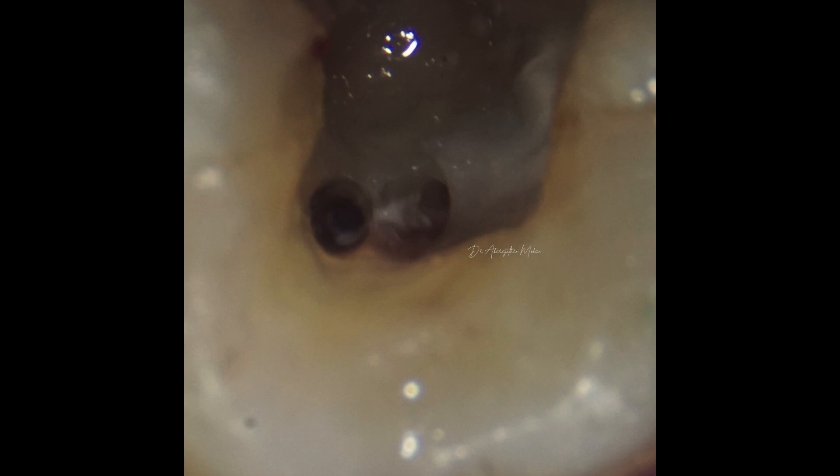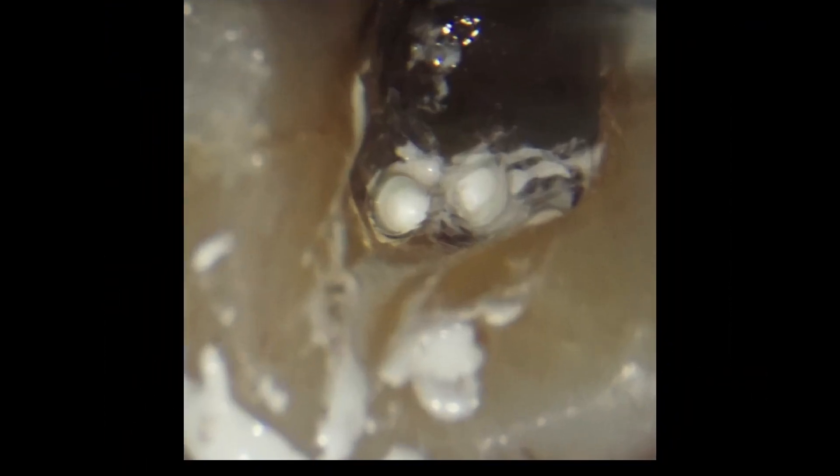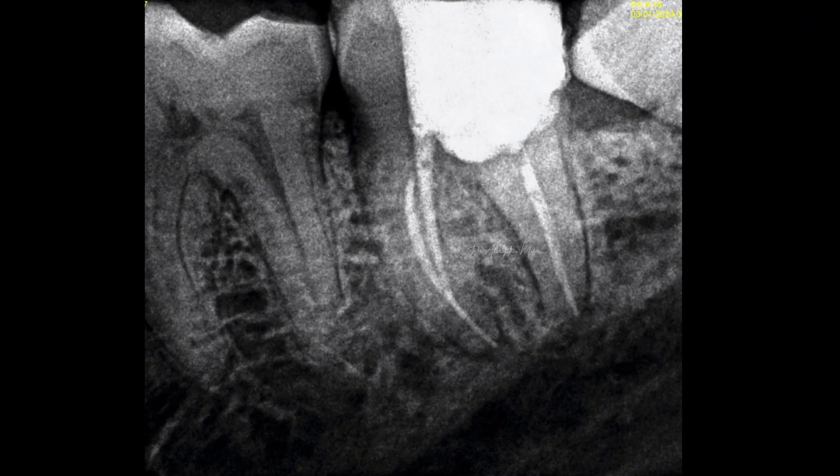Here again you can see that the mesio-buccal and the mesio-lingual orifices were very close to each other. Quite often people locate just one of these canals and think the case has only two canals, or they may be searching for the second orifice really far away. A word of caution: when you are not able to find the second canal in any of these second molars, use magnification — it may be located very close to the first canal you found. This is again a three-canal second molar, obturated with the same technique, and this was the post-op.